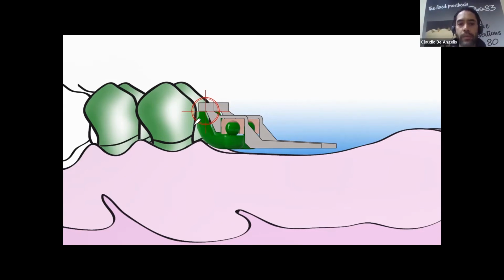If you do a proper job, the fulcrum will be here, and it's perfectly correct. If you cut this part because you fear that it's too far from the teeth or you don't have space or whatever, you will do a huge mistake, because the fulcrum will move here around my sphere, and then this will be, how can I call it, like a clamp which will extract my teeth. Okay, remember this.